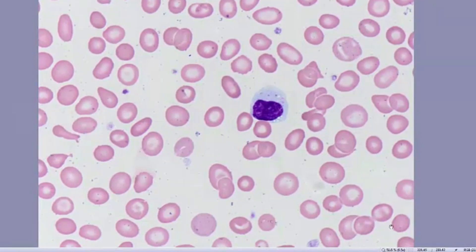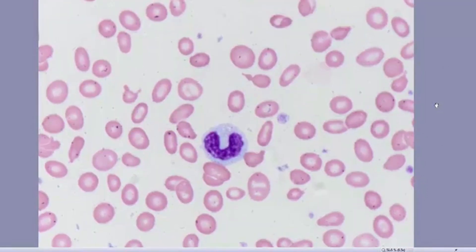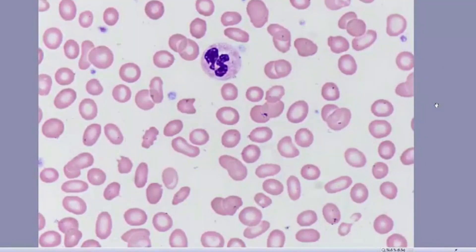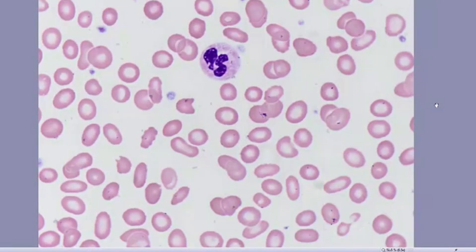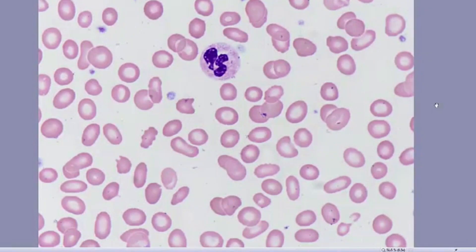Here's a large granular lymphocyte. I'm going to look at neutrophils to see what they look like in terms of their granulation, with the possibility of MDS having hypogranular neutrophils. I'd also like to point out some basophilic stippling in this red cell. Here's a normal appearing monocyte and a normally granulated neutrophil. On careful review of the smear, the neutrophils looked normally granulated and I did not see any blast forms.